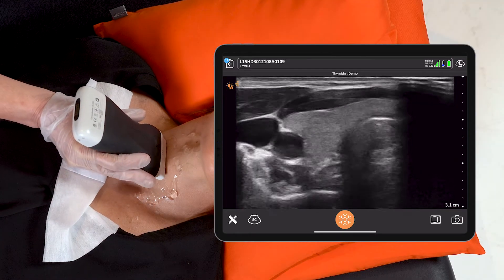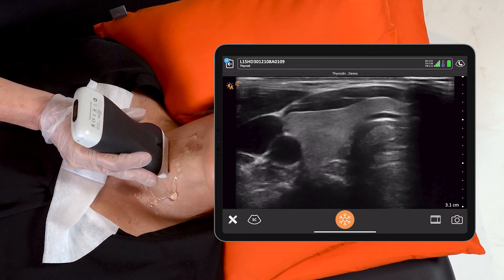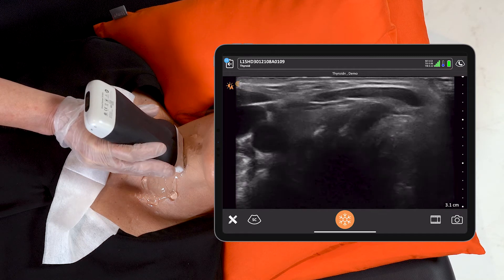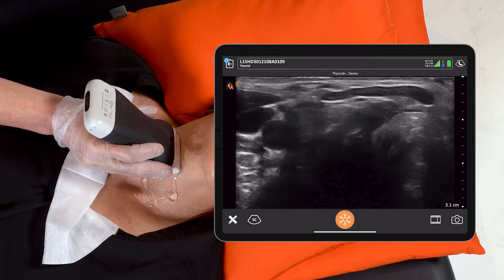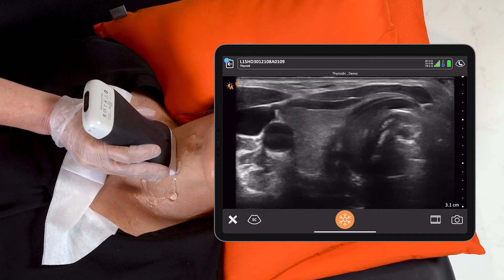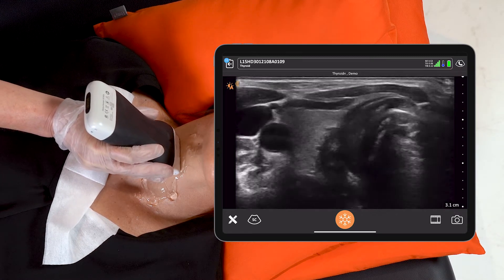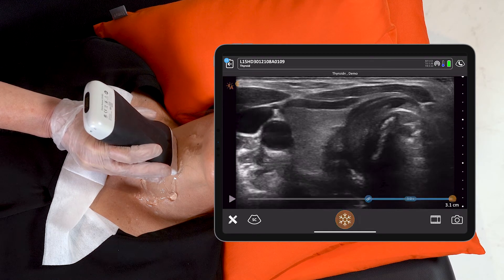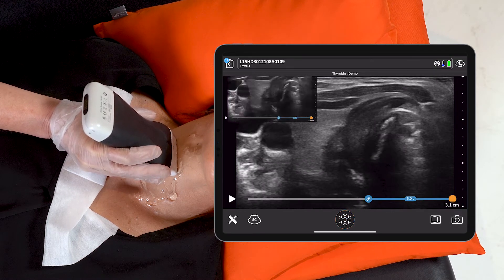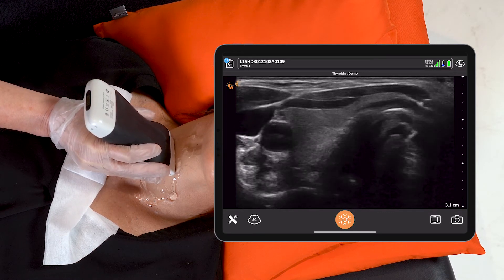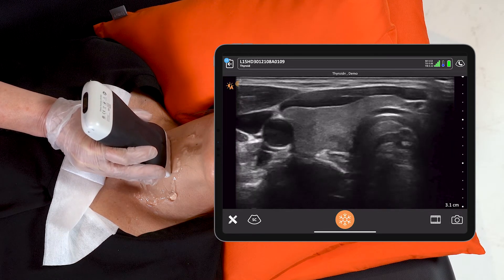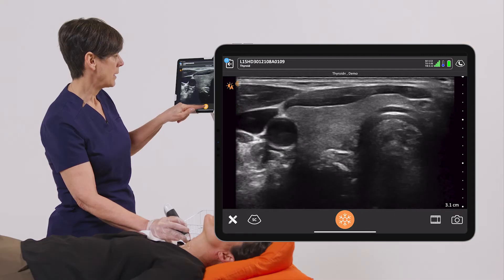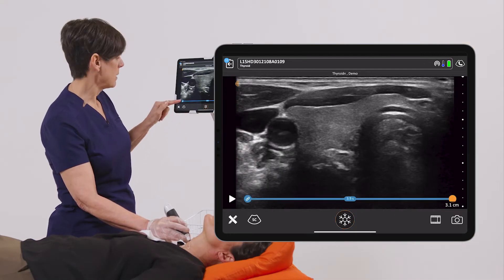Let's head on over to the right lobe of the thyroid. From here I'm going to sweep from the superior aspect of the right lobe, take an image, and go down to the mid-portion. At this point I'm also going to do a measurement.